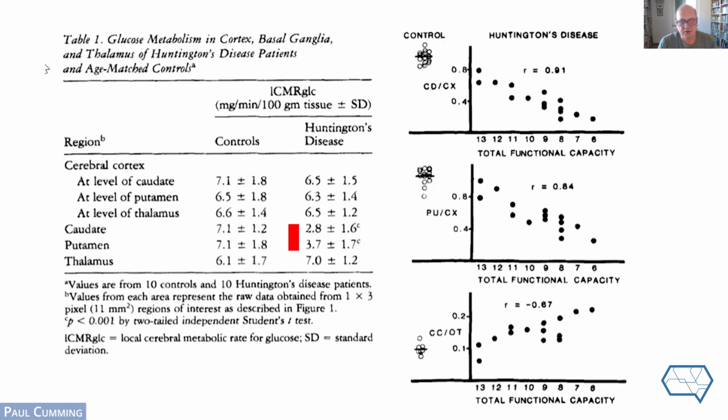Yeah, and this figure extracted from their paper summarizes the results. On the left-hand side, we see a table reporting the metabolic rate that they calculated for different brain regions: in the left-hand figure of the table, control subjects, and on the right-hand side, the Huntington's patients. And the red bar indicates the point of main interest, that this metabolic rate calculated from dynamic FDG PET recordings is enormously reduced, really by more than half, in the caudate nucleus and in the putamen of the unfortunate patients with Huntington's disease. And that represents a massive loss of metabolic activity.